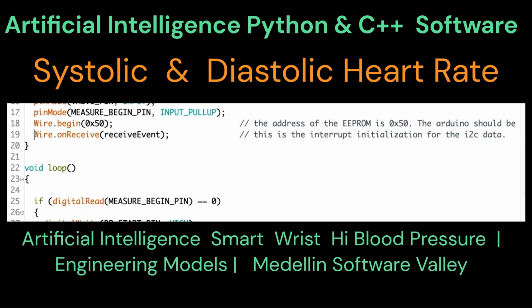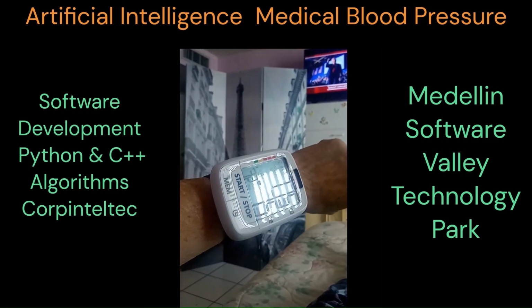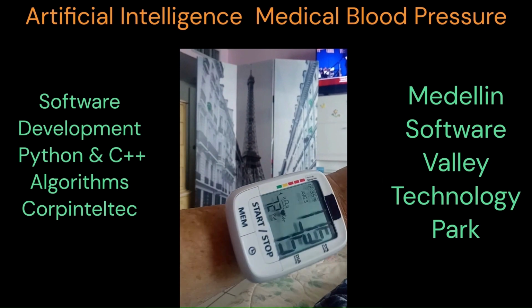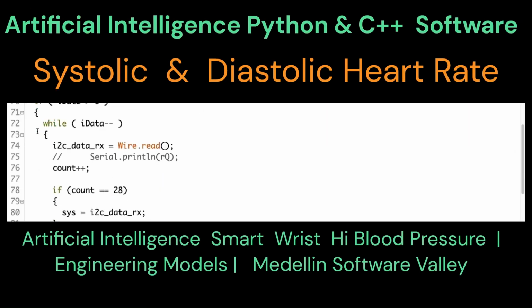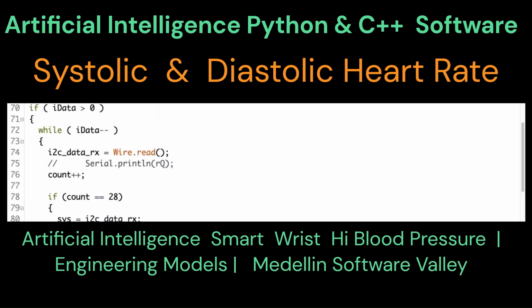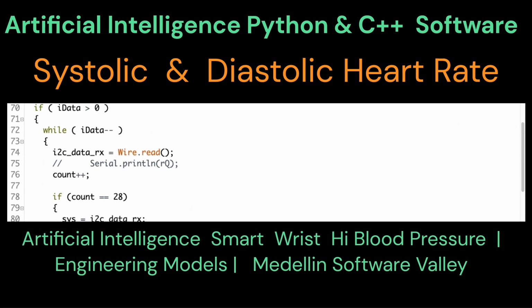With the cuff positioned at the radial artery of the user's wrist, the band air pocket was inflated to expand the cuff, compressing the radial artery and measuring the pressure change on the cuff through the beating of the radial artery.